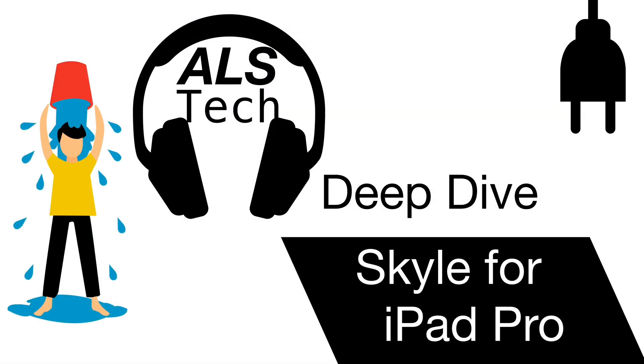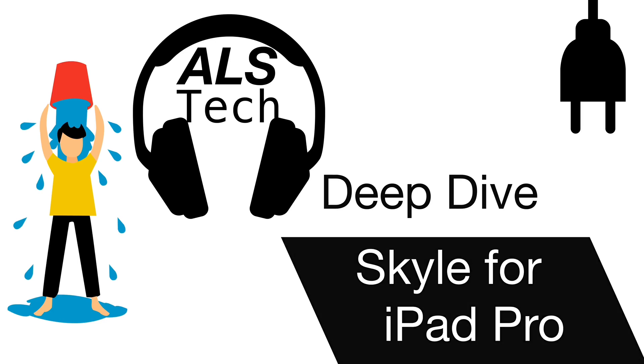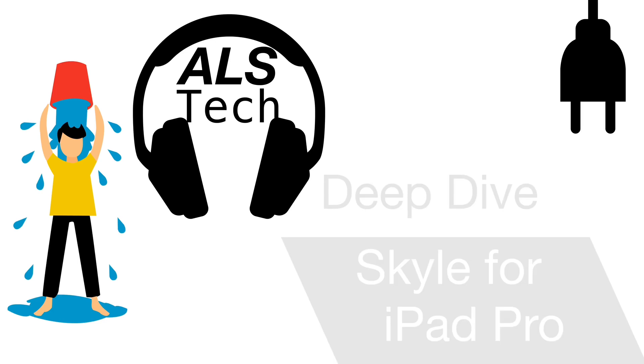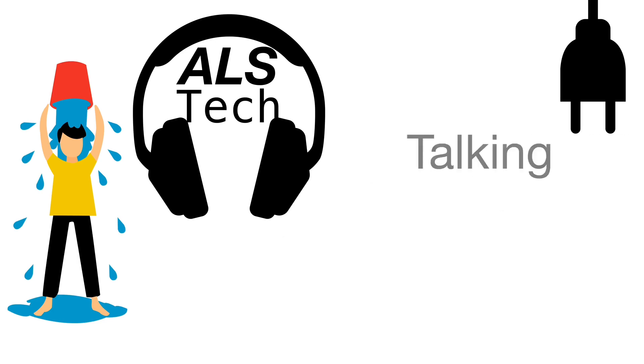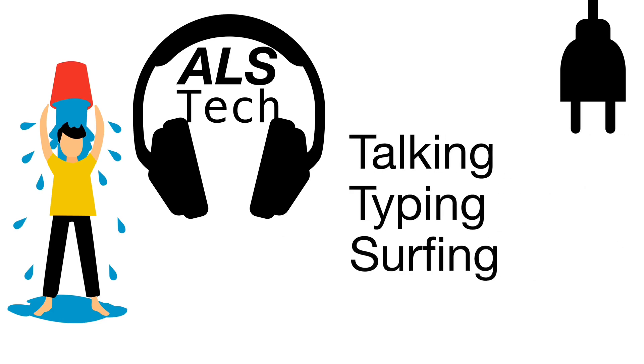That is the end of our deep dive into using the Skyle for iPad Pro. I hope you felt all the thrills of a great action movie. We covered talking, typing, surfing, and settings.